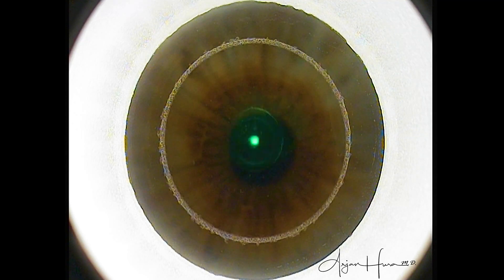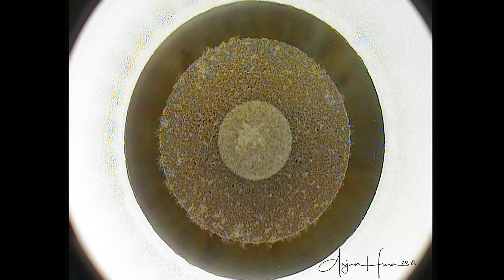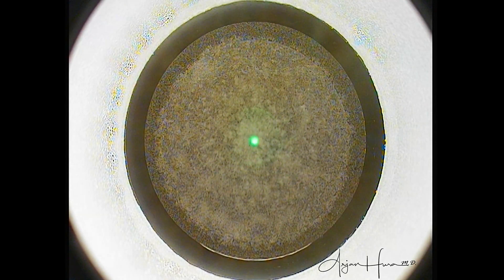This first outside-in pass of the laser is known as the refractive cut, or the lenticule cut — this is what is actually treating the patient's prescription. Next, the side cut in the periphery creates the edges of the lenticule, then this inside-out cut creating the cap, or the top of the SMILE pocket. And then finally, the superior incision is made to give us easy access for lenticule extraction.